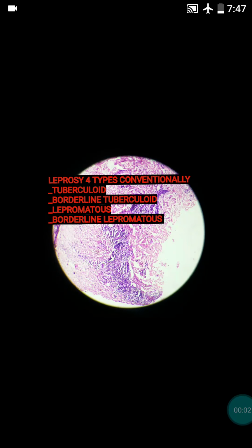Hi friends, today I will teach you borderline lepromatous leprosy. That is a very important topic from the pathologist and exam point of view. Leprosy is caused by Mycobacterium leprae bacilli. It is mainly a skin infection.